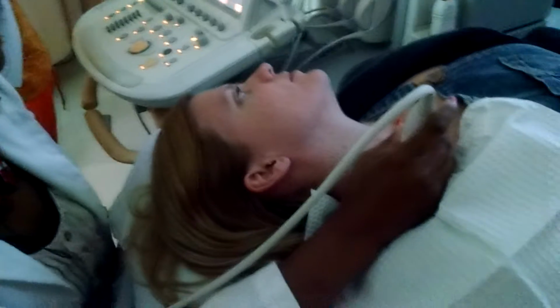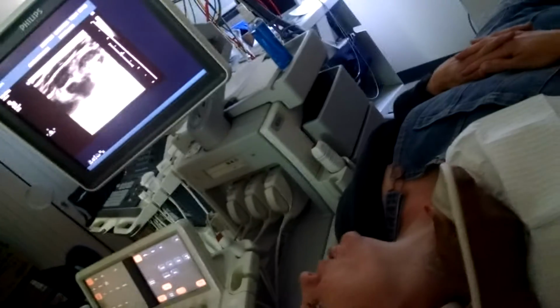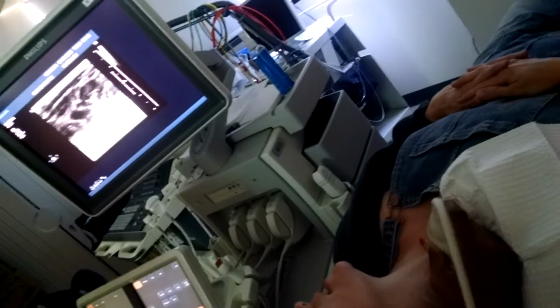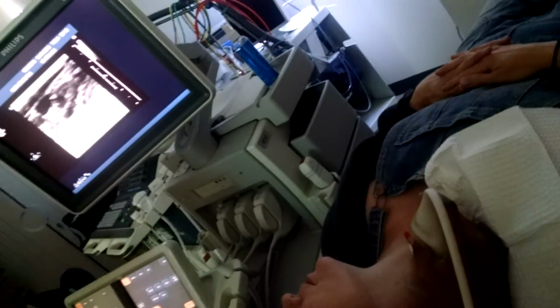Superior or inferior? Yeah, that's what I meant. Yeah, I can't tell if that's the vein or the artery. It's just the artery, actually. Oh, but it shows it longitudinal, right? It will show it longitudinal because it's going towards the arm. Okay, right.